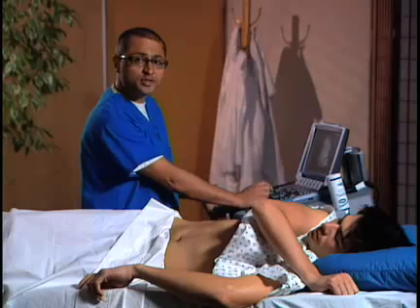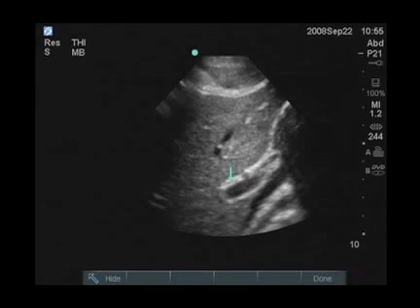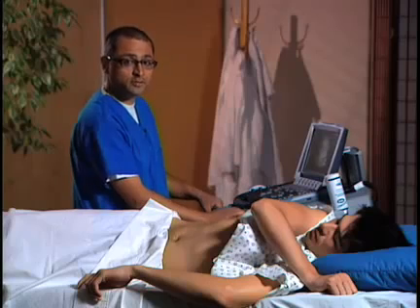Okay, I'm going to illustrate to you where the hepatic artery is. We can see first this is the portal vein right here. Right above it is that little anechoic stripe, which is very tiny and difficult to see because this bile duct is normal. This is the common bile duct. But right adjacent to here is another anechoic structure, which is the hepatic artery. If there's ever any confusion of what you're measuring, you can easily turn the color flow on to differentiate the two.